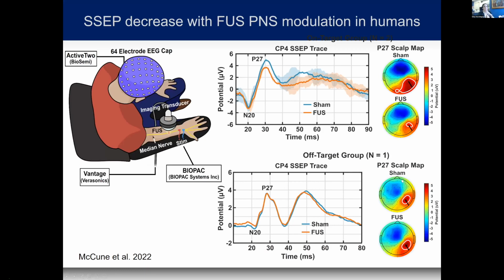And then we switched to EEG, and we collaborated with Paul Scheider's group here at Columbia that does EEG and fMRI in psychiatric disorders actually. So they guided us through the different processing that we need to do, and we got the 64 electrode EEG BioSemi cap that's worn now by all the subjects. And we were trying to see whether the pain rating level with the suppression of the EEG signal could actually be detected.